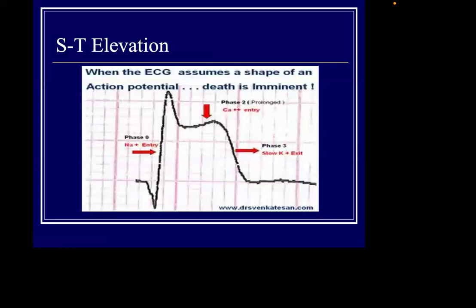And usually people in the past would say that if you see a Q wave in the ECG, this myocardium is dead and the patient is already infarcted. This is in the past. But now, with the introduction of the CMR, people found that the Q wave sometimes comes early, before 12 hours.